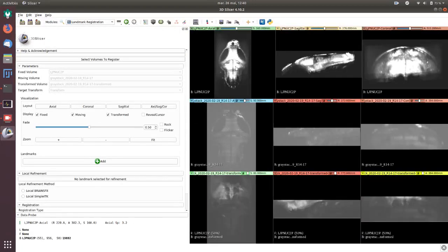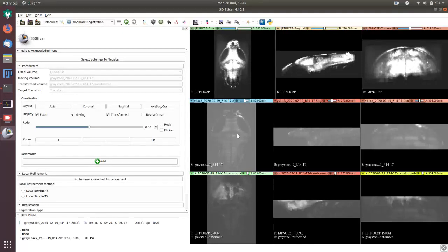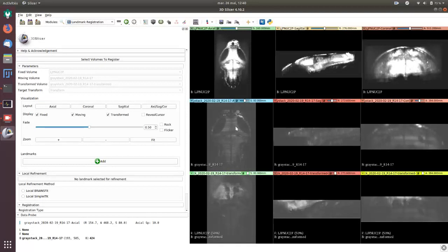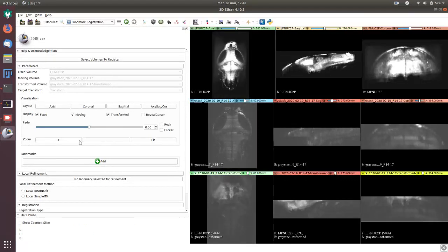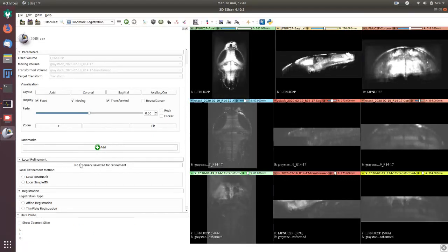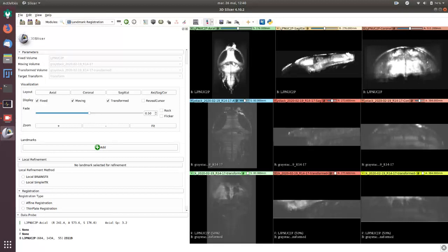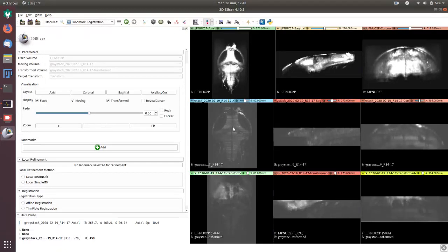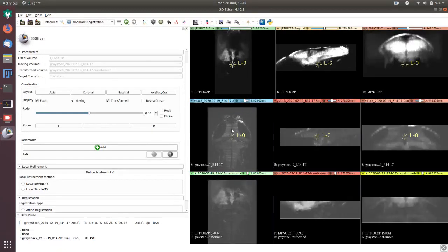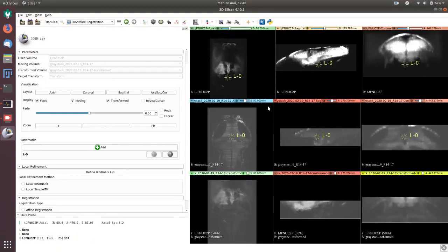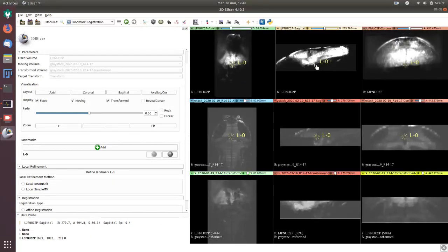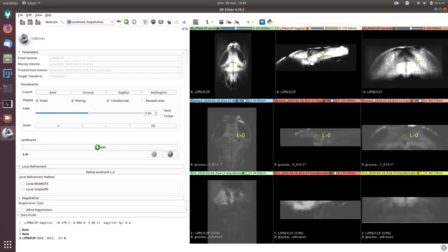So here we have a free panel view where we can adjust the contrast individually on the runs. We're going to add landmarks, for example in a region that is easy to see in all the brains. We can see these two commissures and we place a landmark here. It's completely out of range which is normal because it's the first landmark.